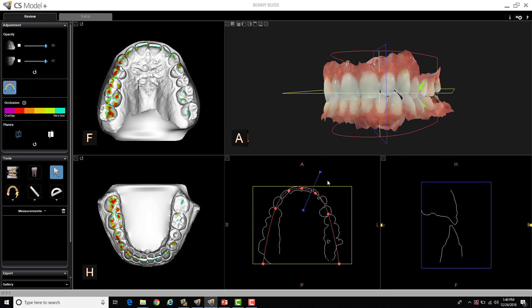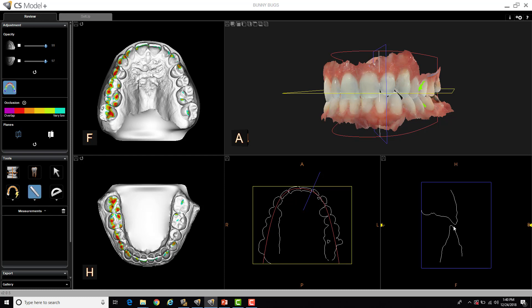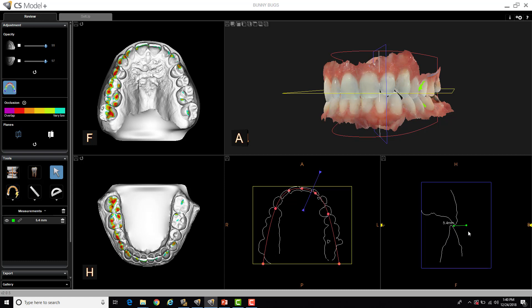While we're on this topic, you can actually take measurements of different areas in the software. So I can actually select my ruler tab, and if we had a larger overjet, for example, I can take a measurement, left-click and let go, and then left-click again, and I get an actual measurement of 5.4 millimeters. This is all one-to-one data. There's no distortion, just like CBCT.